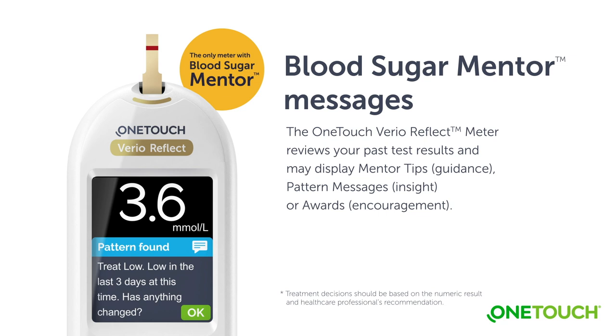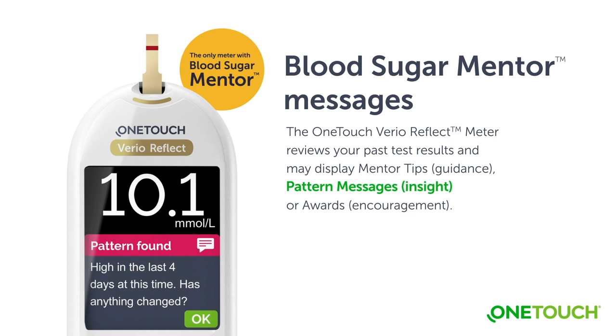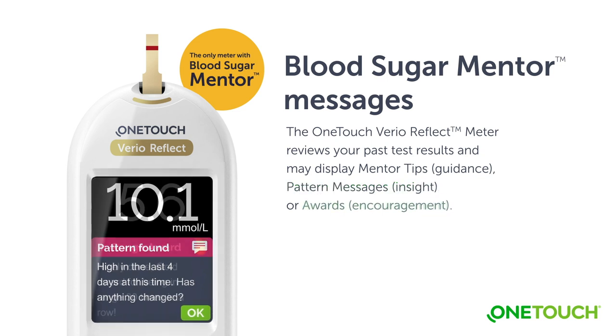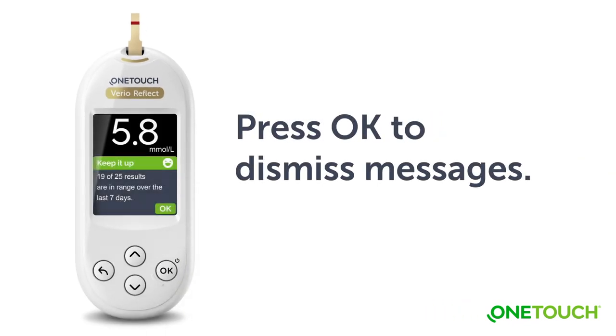The OneTouch VarioReflect Meter reviews your past test results and may display mentor tips, guidance, pattern messages, insights, or awards. Pattern messages appear when the meter identifies a pattern of glucose results that fall outside the high and low range limits you set in the meter. Awards are earned when certain award criteria are met, such as meeting the daily test goal. Encouragement messages help motivate you to stay on track and achieve your diabetes management goals.